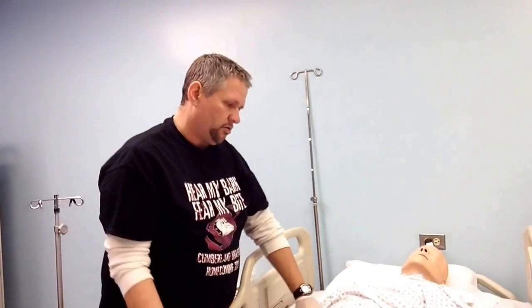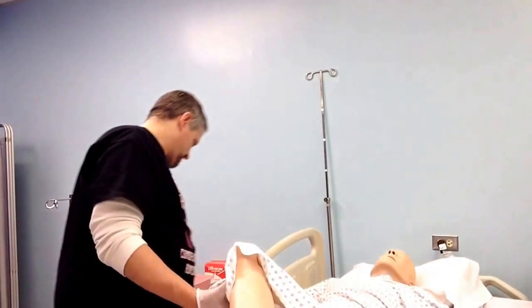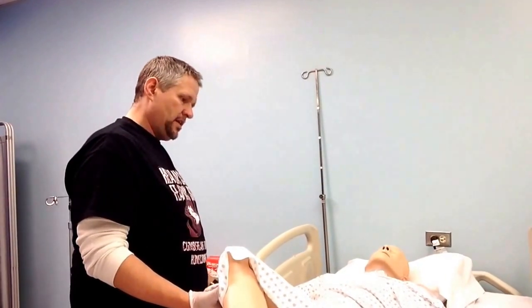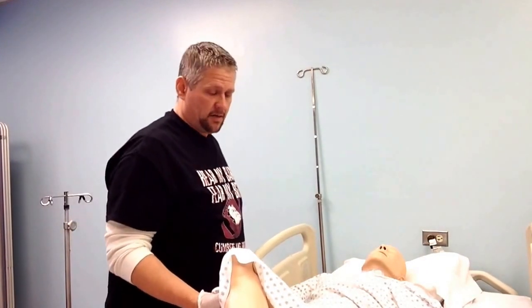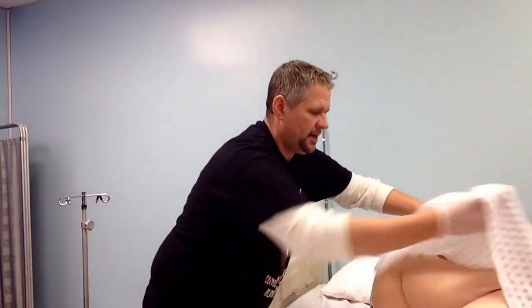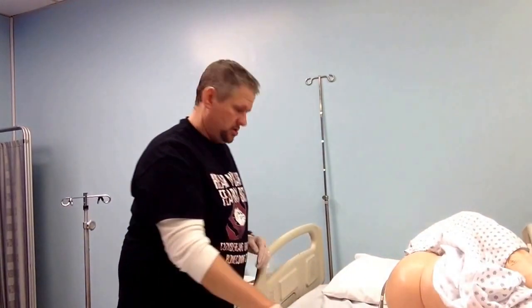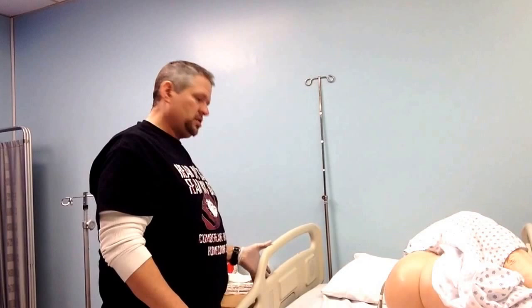We're going to go ahead and roll the patient into Sims position. I would have assistance if we needed it, but Mr. Pierce is able to assist me in rolling and moving his leg. We're going to uncover him here so we are ready for the enema.